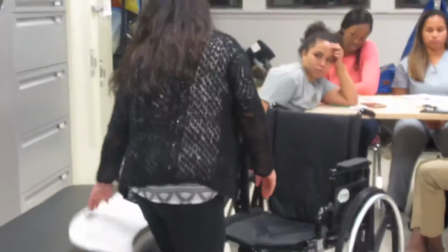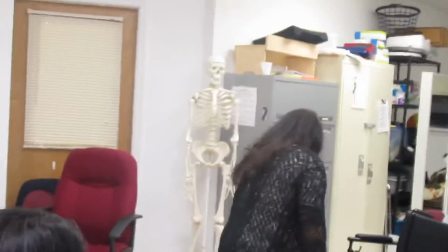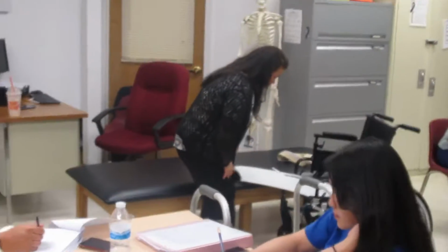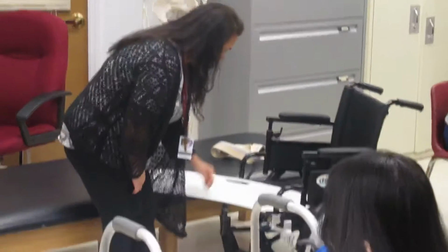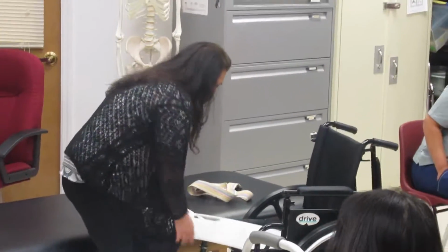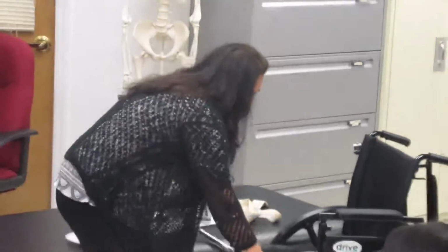Same with any other thing, right? With a slide board, you want to definitely remove the armrest. If you don't, this board is not going to fit properly. It's going to fit like this. Your patient can fall right here. So the armrest has to go up so that the board can get even closer, as close to the surface as possible.